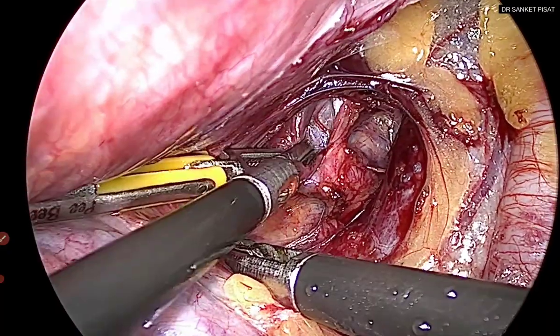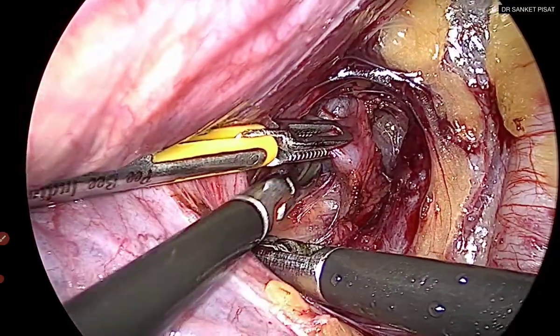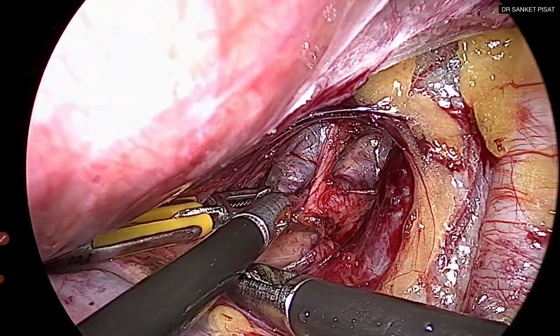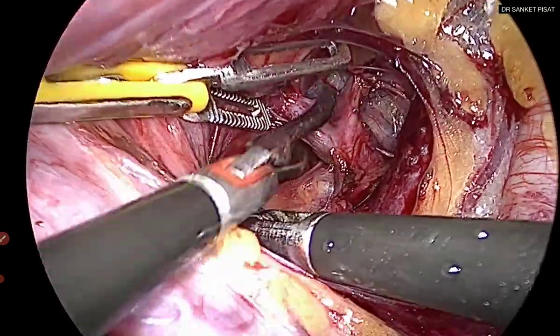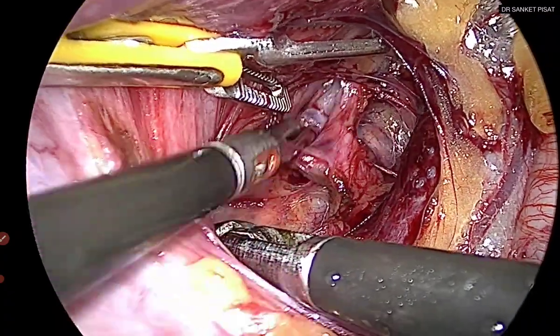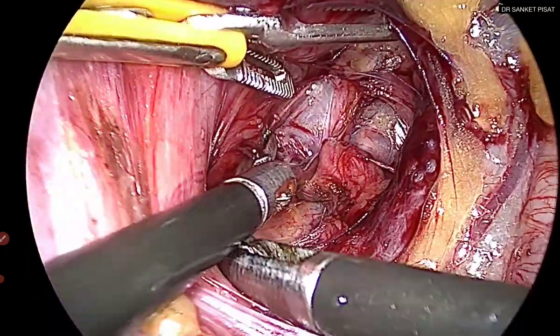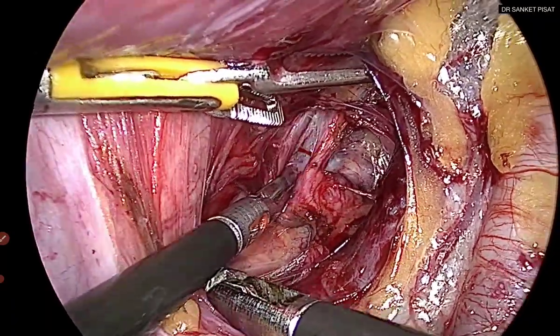Holding the uterine artery is not going to do any damage — it is a very strong vessel; it is the vein we need to worry about. In this case I have chosen to demonstrate ligating the uterine artery by passing a suture around the vessel. However, even if you cannot do that, it is sufficient to do this much dissection and coagulate the uterine artery — one does not have to cut the uterine artery at any point to perform uterine artery ligation. Personally I think ligating is better because it gives complete obliteration of the lumen with no lateral spread of thermal energy to the ureter.